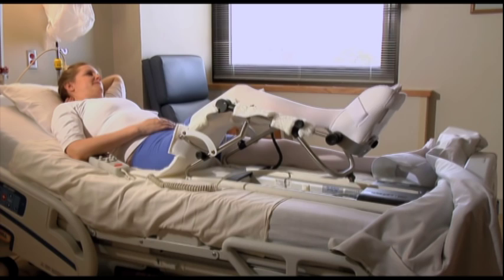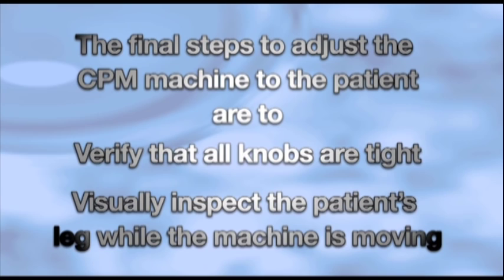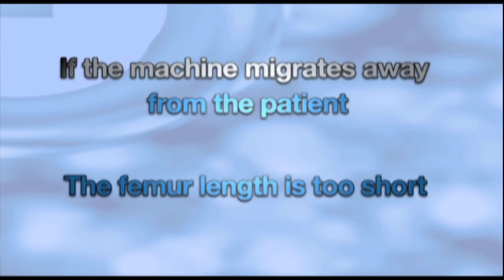The final steps in adjusting the CPM machine to your patient is to verify that all knobs are tight and to visually inspect the patient's leg while the orthosis is moving. If you notice the patient's foot lifting out of the foot cup or boot, the femur length is likely too long. If the machine migrates or scoots away from the patient, the femur length is likely too short.